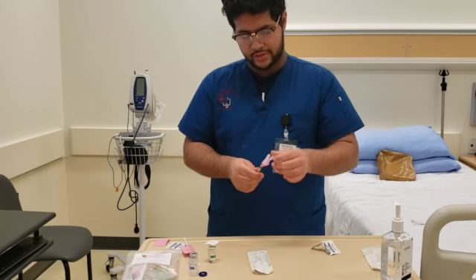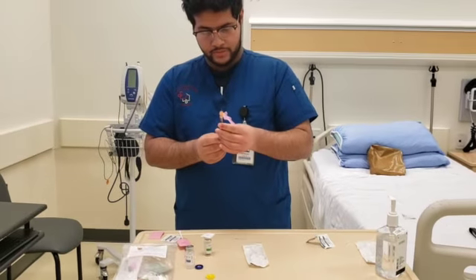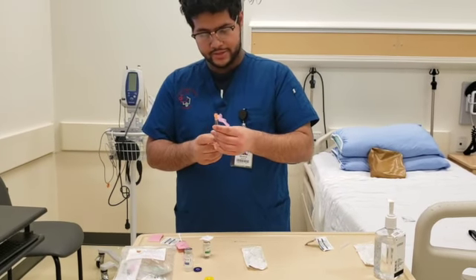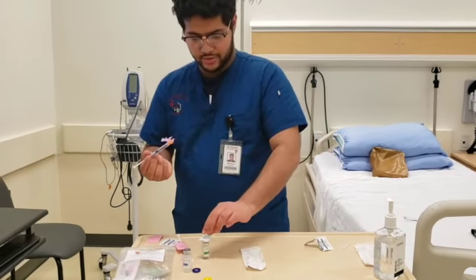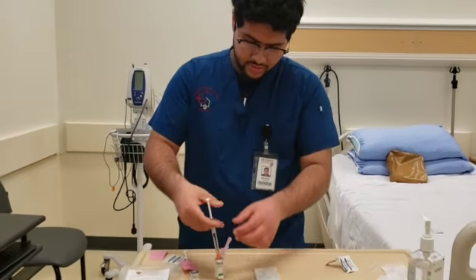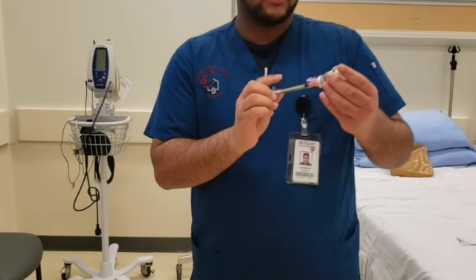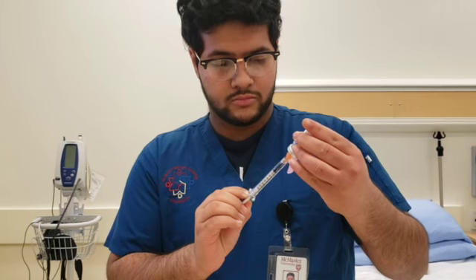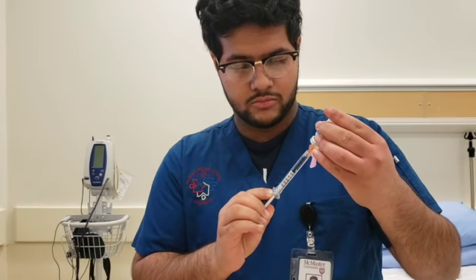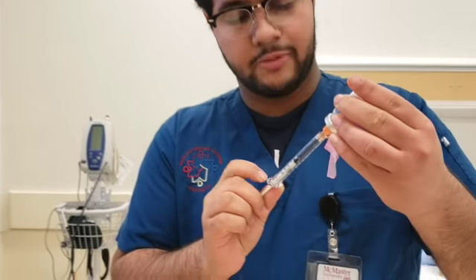Lock it, move the safety cap back, take this off. Put 0.5 milliliters in there. This is done, so then we're going to aspirate this. This is done so we don't lose any medication. Again, I'm going to draw a little bit more than 0.5 milliliters just because there is an air bubble in there.